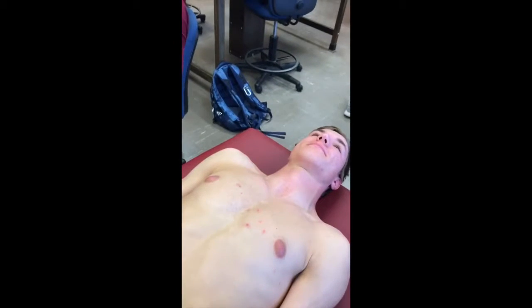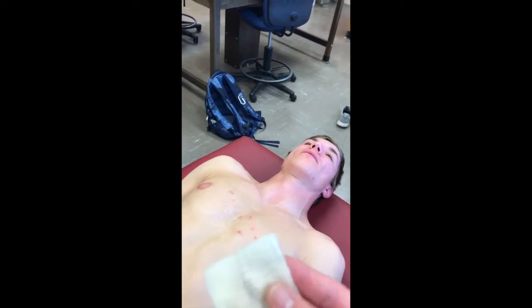What you're going to need for a complete ECG is alcohol pads, gauze pads, rubbing alcohol, and ten leads. Your next step is to get rubbing alcohol and gauze pads and saturate your gauze pads with the rubbing alcohol. You want to rub and clean your patient until his skin turns red, like so.